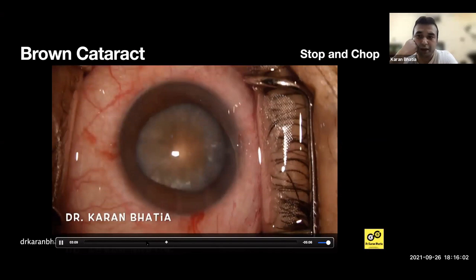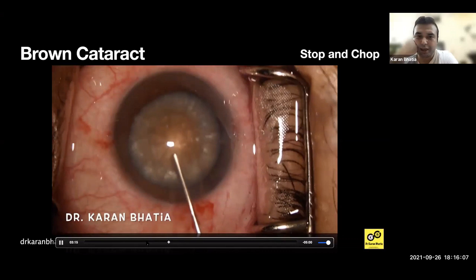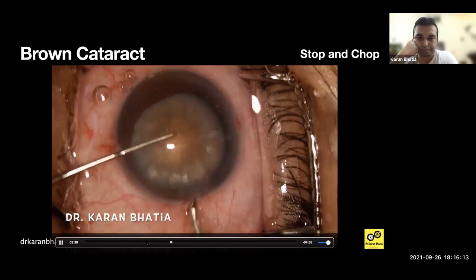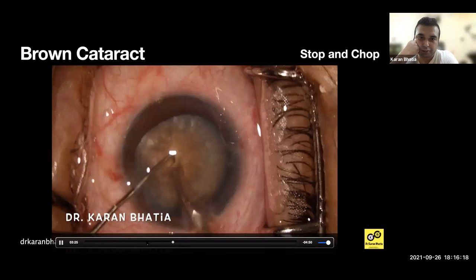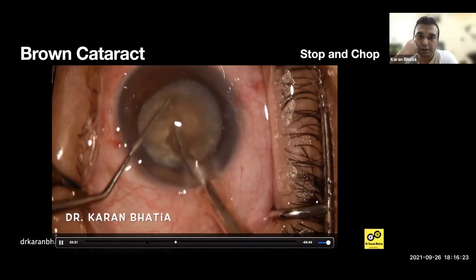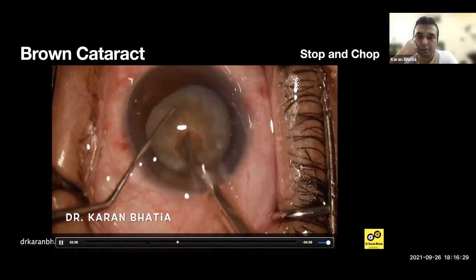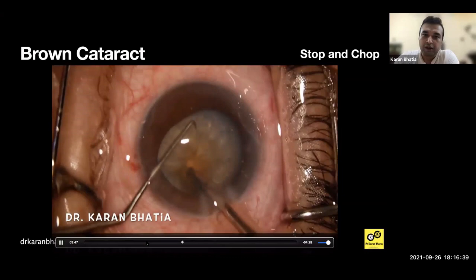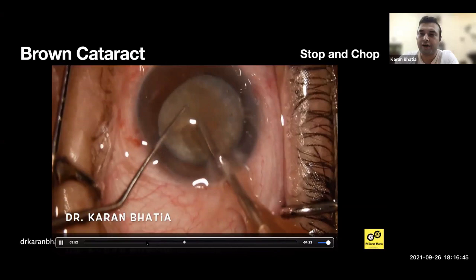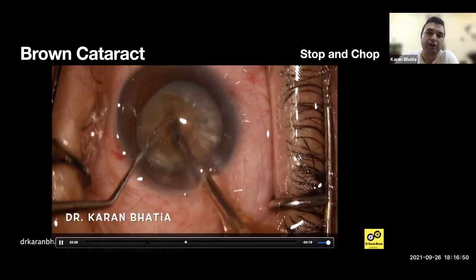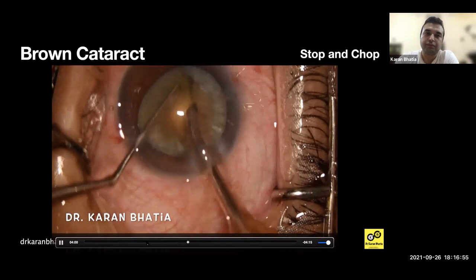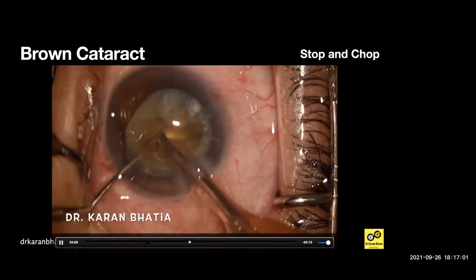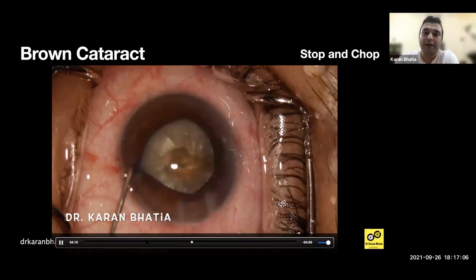Now you should inject OVD and use a high molecular weight dispersive OVD to protect the endothelium. Then FACO is started — here I'll be doing a stop and chop. I'm making a slightly bigger groove. Even if it rotates toward one side it's okay — it's kind of like a crater. You have to go to about 80-90% depth. Many people use two hands to separate the two halves in stop and chop, but I prefer to use the FACO probe since the irrigation is on.